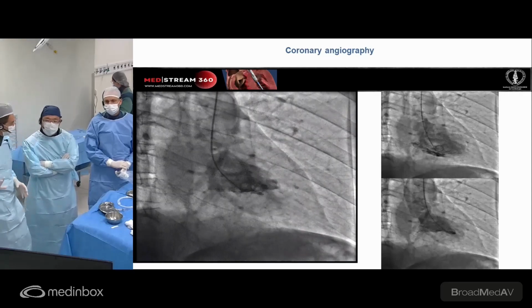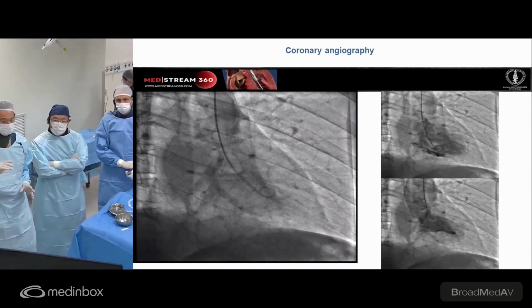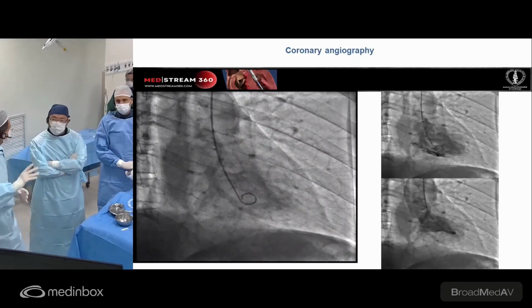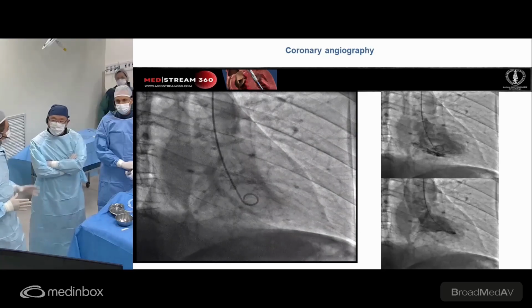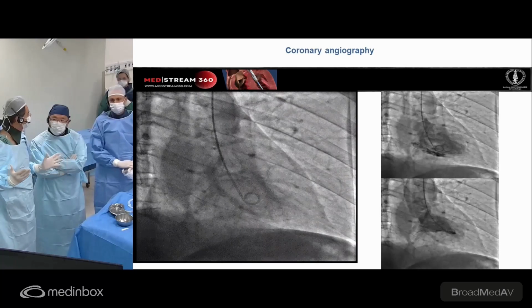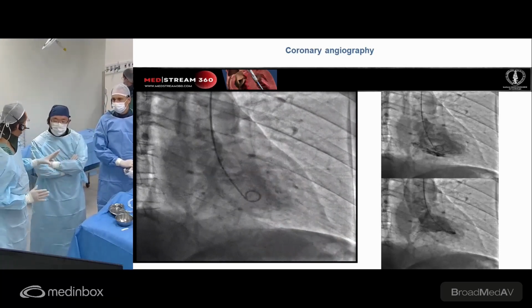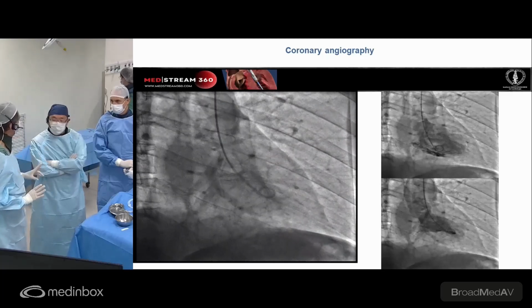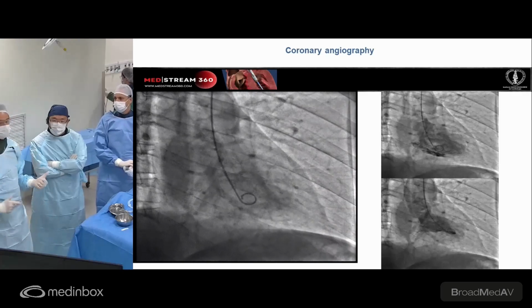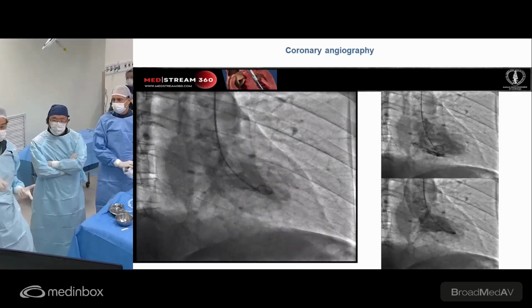Luis, you have this patient, 2 months after an MI, with a total occlusion in the LAD, as you can see here. I would say it's a normal LV function with the ejection fraction, and the patient is stable with angina class 2. So what is your decision? Would you keep this patient under medical treatment only? Would you send him to surgery?